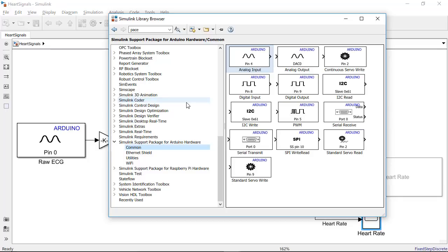So when I downloaded the Simulink support package for Arduino, I got this library which contains blocks that allows me to communicate with different styles of sensors that are connected to an Arduino.